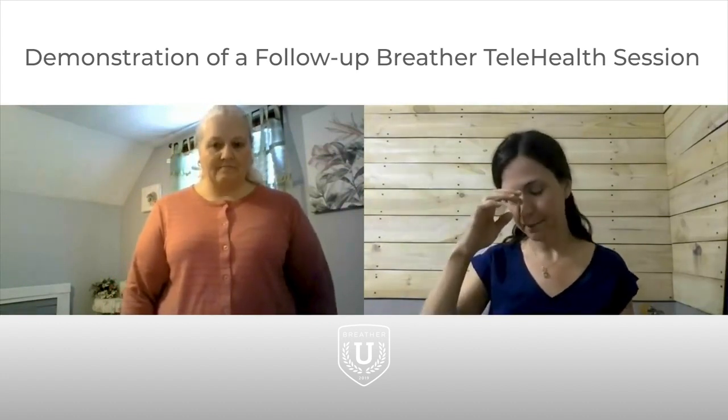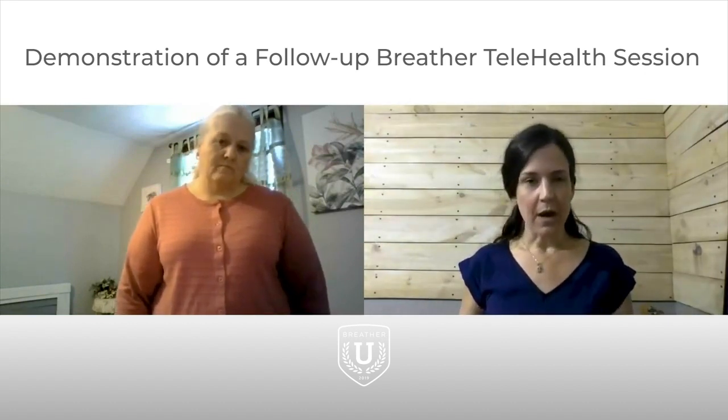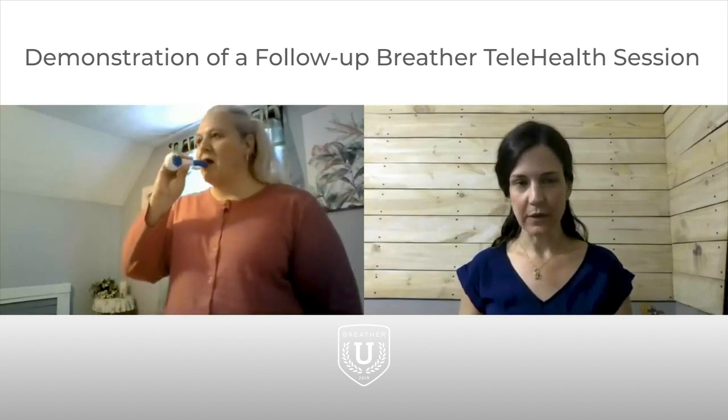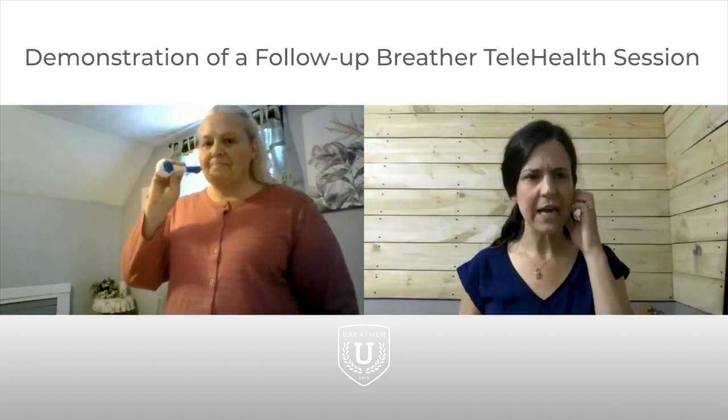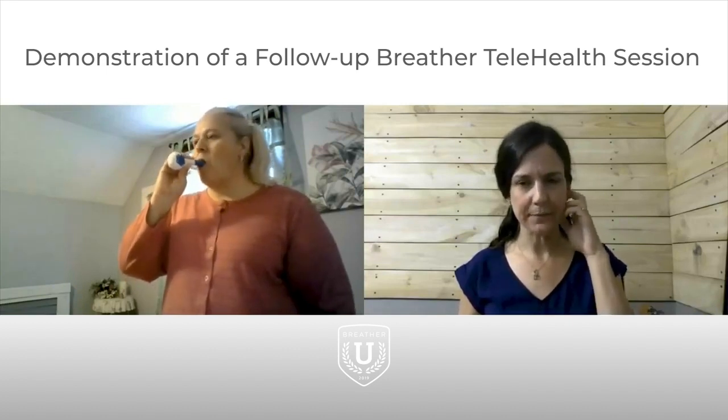Good. So you feel like it's helping, and it looks like in the data we're collecting that it is helping. Yeah, I feel better. Let's go ahead and do a set of 10 where we're already at, and let me see how you're doing. Whenever you're ready. 10? Yeah, for your regular set.